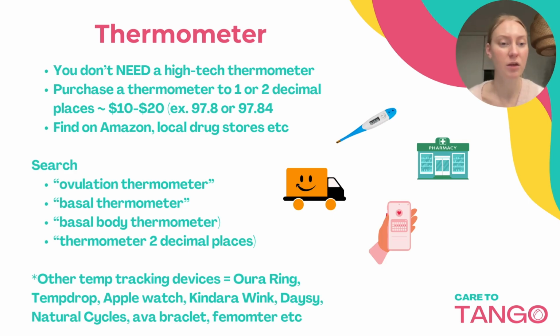Instead of using a thermometer every day, you can get one of those, which will measure your average sleep temperature, but not your BBT. So you can't get the information about your metabolism, because using a thermometer is going to give you that basal body temperature. But the helpful thing with the device is that it's easy and quick, and if you're prone to wake ups or work night shifts, or if you are postpartum and have a little one keeping you awake, or you simply don't want to take your temperature every single morning, these can be a great option because it's taking your average temperature.